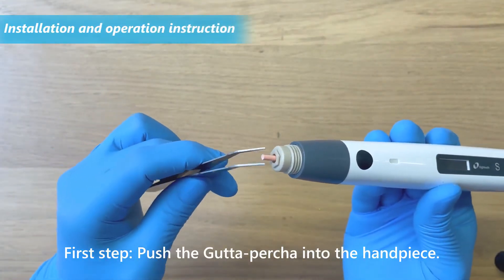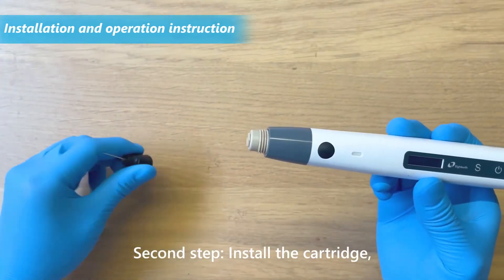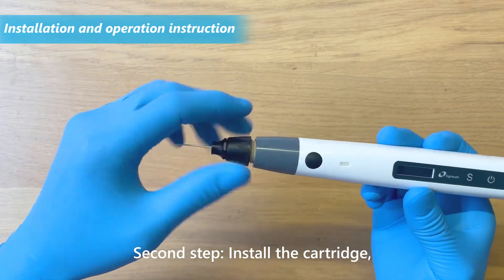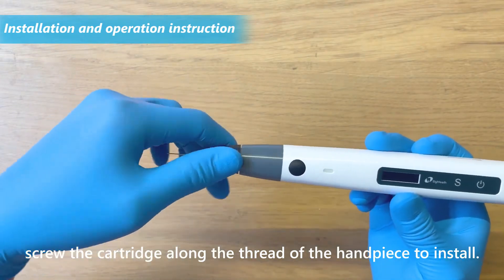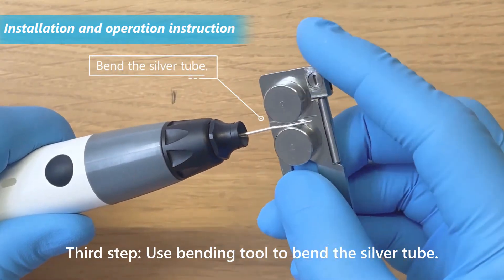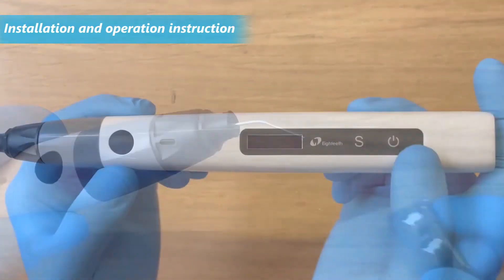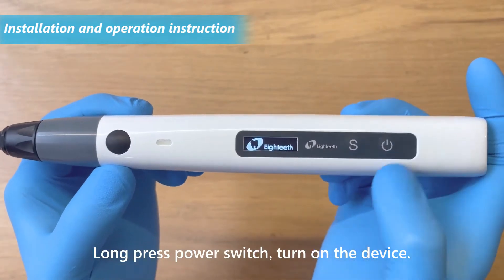First step: push the gutta percha into the handpiece. Second step: install the cartridge, screw the cartridge along the thread of the handpiece to install. Third step: use the bending tool to bend the silver tube.